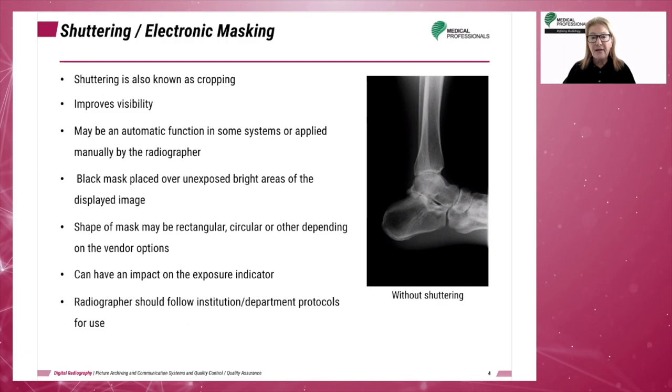Note: in 2015, the American Society of Radiologic Technologists, or ASRT, took a strong position against the use of masking or image cropping. The position statement reads, "A digital image should not be cropped or masked such that it eliminates any areas of exposure from the image that are presented for interpretation. ALARA standards require all irradiated anatomy be presented to the interpreting physician."